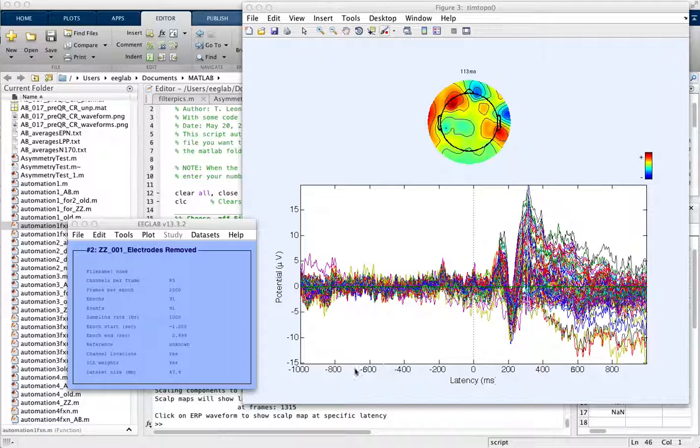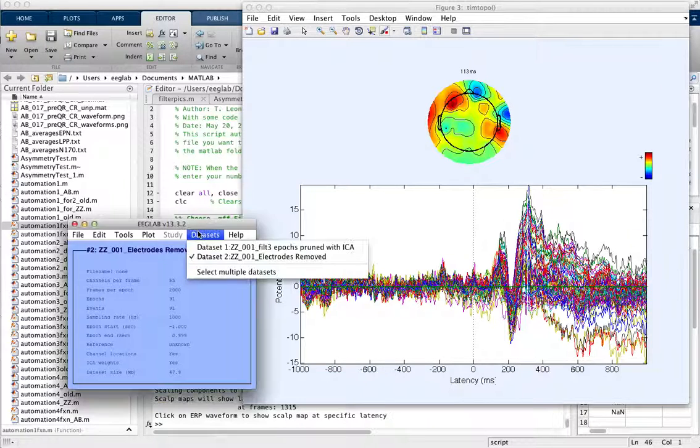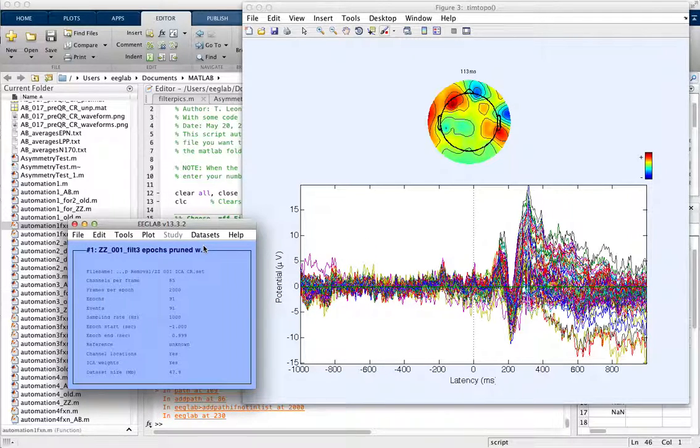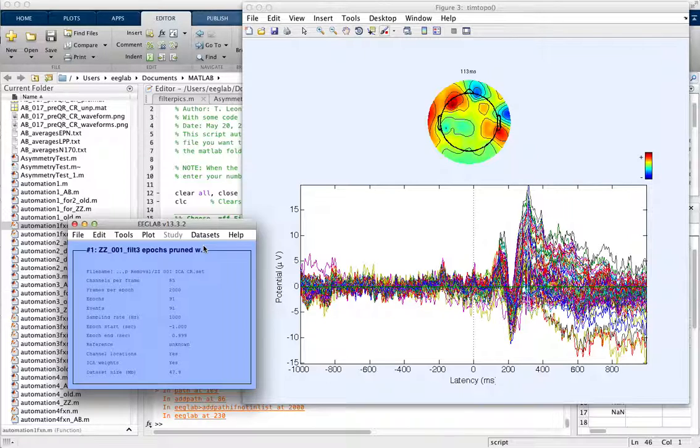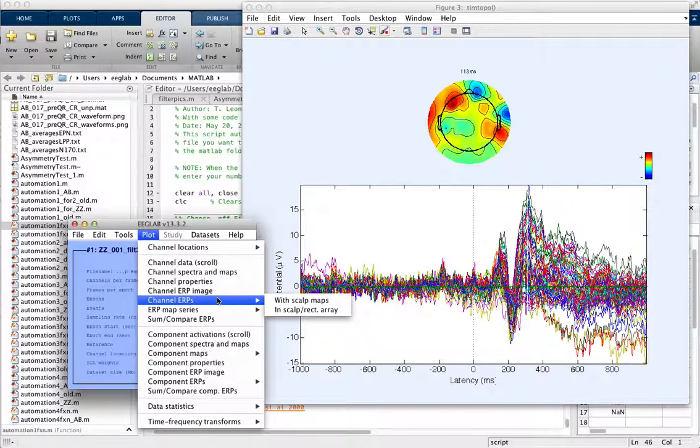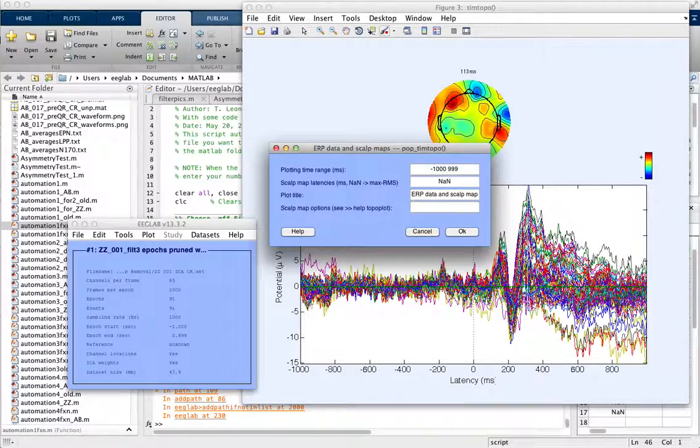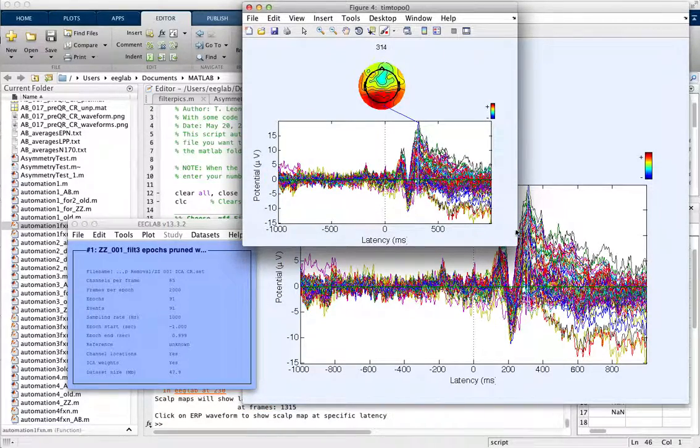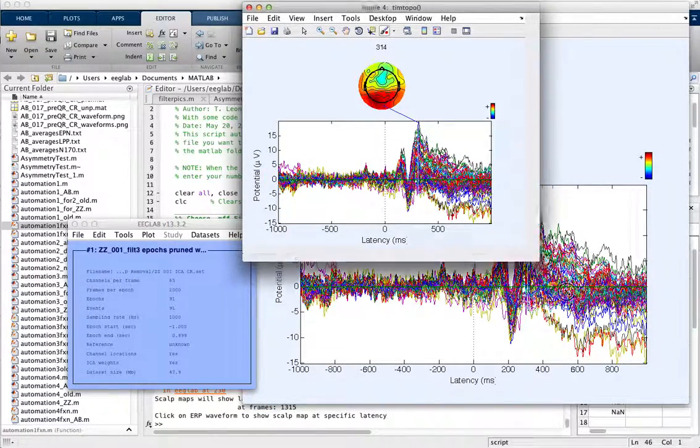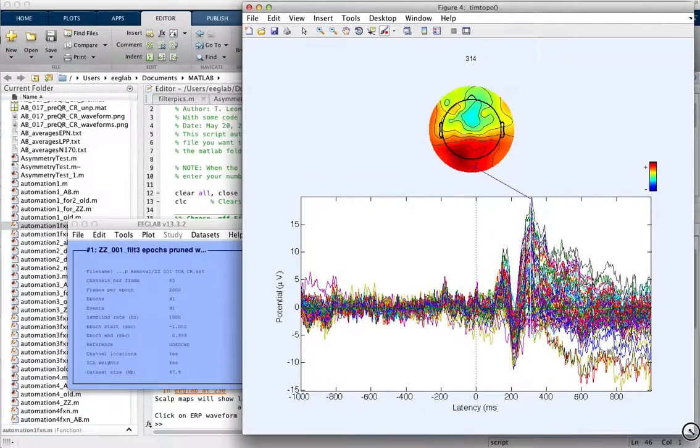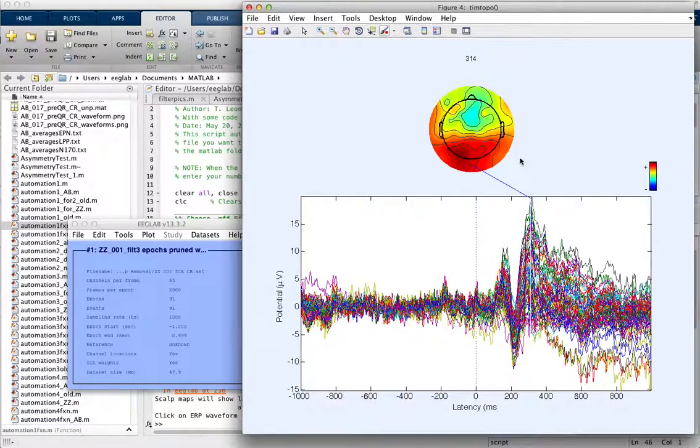This is how and when to interpolate electrodes. Here we have a data set and I'm going to plot the channel ERPs with the scalp maps. I've already uploaded this data set into EEGLAB and now we're looking at some of the head plots here.